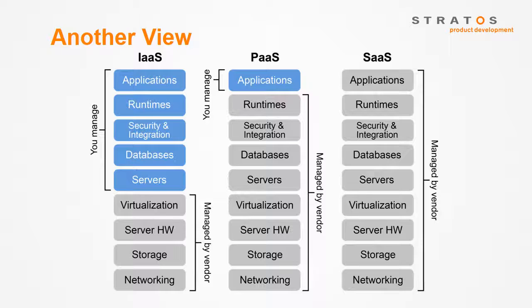And here's what's not always obvious. Whether you use IaaS or PaaS to implement your system, or a combination of the two, your product will ultimately contain one or more SaaS applications. In other words, though as developers you are cloud services users, as an organization you will be a cloud services vendor. As a vendor, your organization becomes responsible for the entire system beneath it.